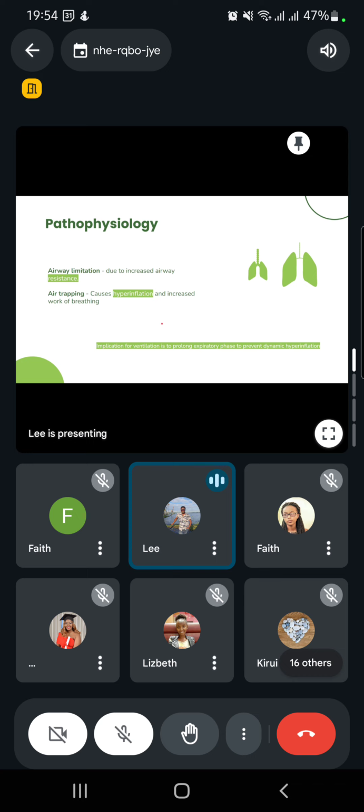So as you're trying to breathe, inspiration you can always control and make more profound or faster, but expiration you have little control of. We'll see how this translates in the vent.